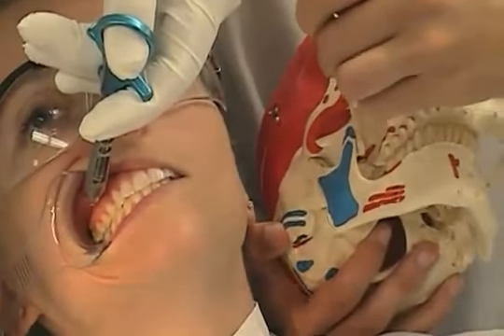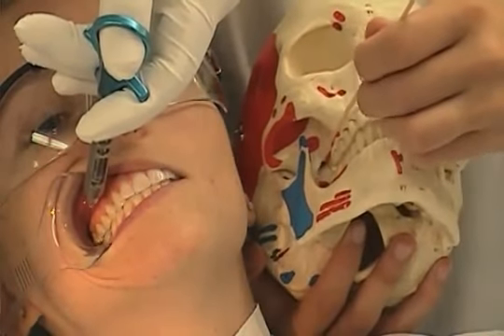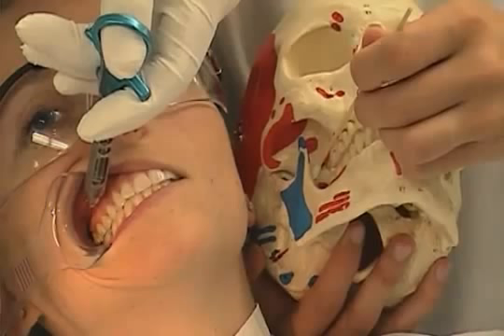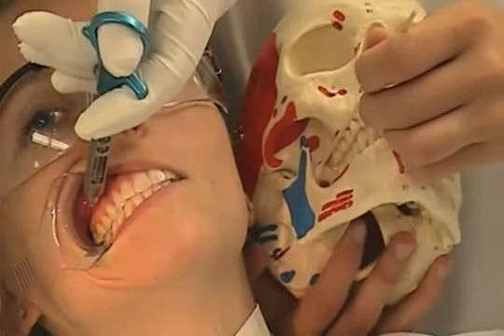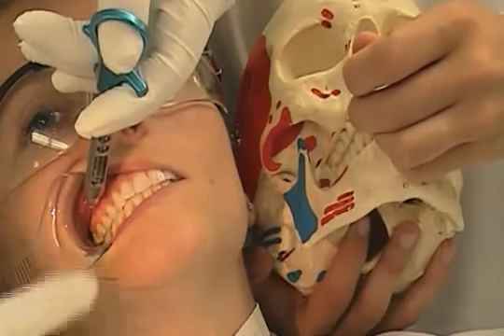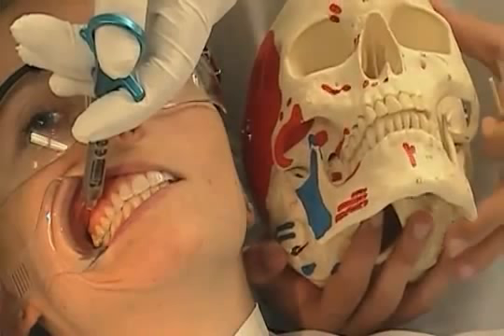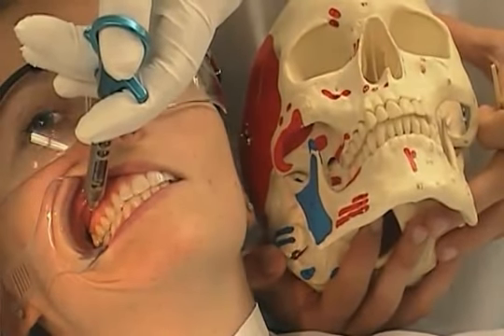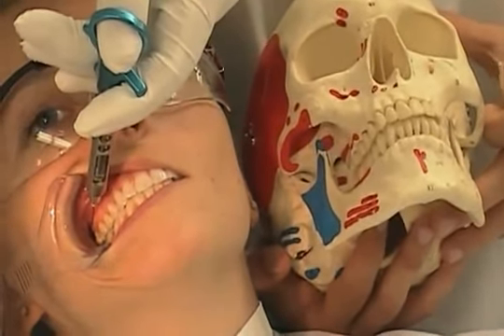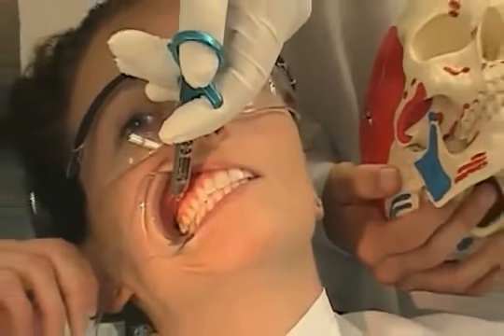Orientation of the bevel: the bevel must be oriented away from the bone of the mandibular ramus. Place your left index finger or thumb on the coronoid notch, reflecting the tissues of the medial aspect of the ramus laterally. Reflecting the soft tissues aids in visualization of the injection site and decreases trauma during needle insertion.